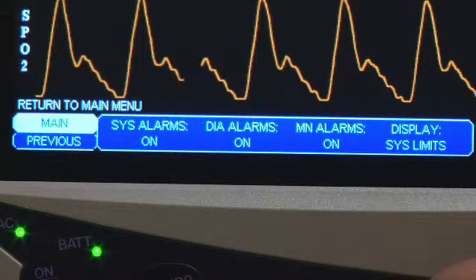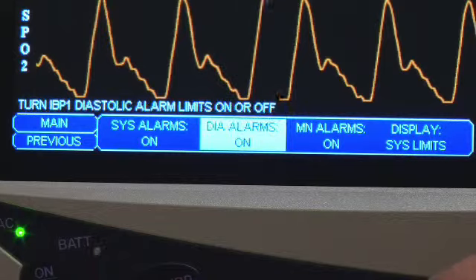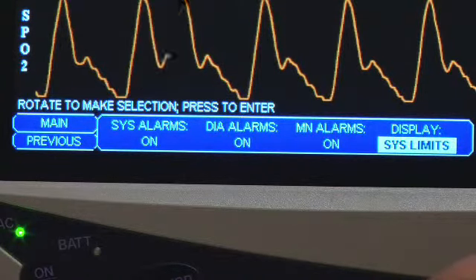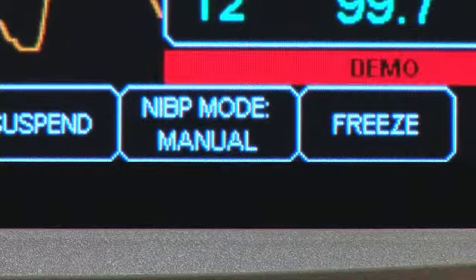The waveform is named after the site label, and selecting this area allows the scale and speed to be changed. Waveforms can be separate or overlaid, heart rate displayed, and the pressure can be zeroed. Printing a strip or snapshot of this parameter can also be done here.